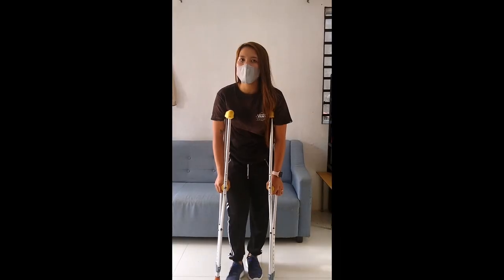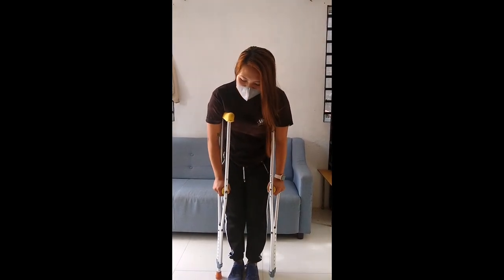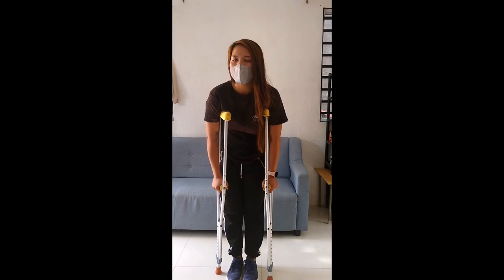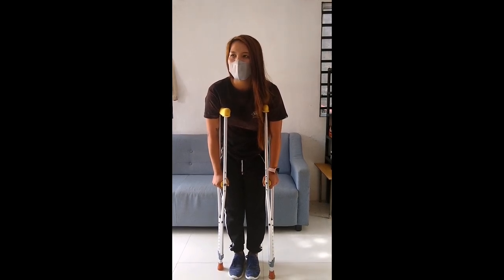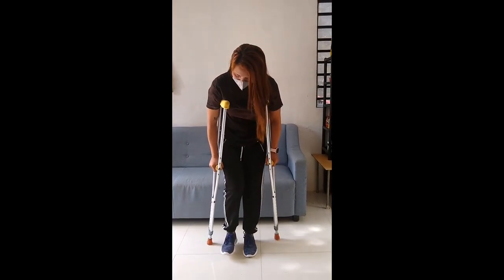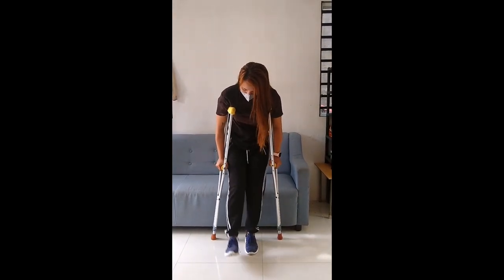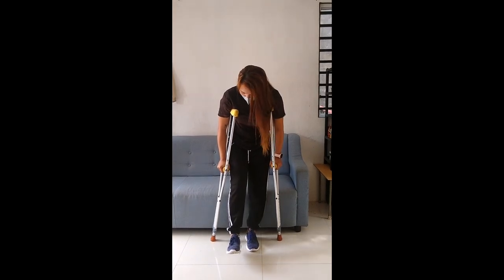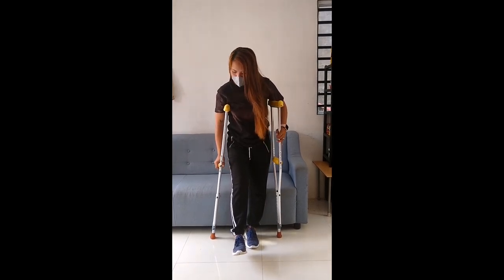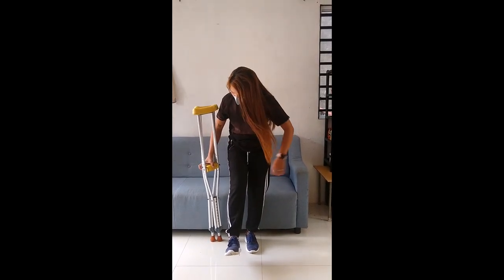Sa susunod nating step ay yung pag-upo at saka pagtayo sa upuan. Kailangan nyo po itipil yung mauupuan nyo ng good leg nyo. Ang una ay yung crutches nyo ang mauunang mag-upo. At dahan-dahan nyo ilalayo yung bad leg nyo. Pag na-feel nyo na yung uupuan nyo, i-set aside nyo na yung isang crutches. Dahan-dahan din pati yung bad leg nyo.